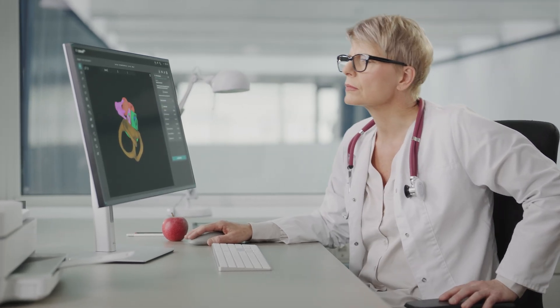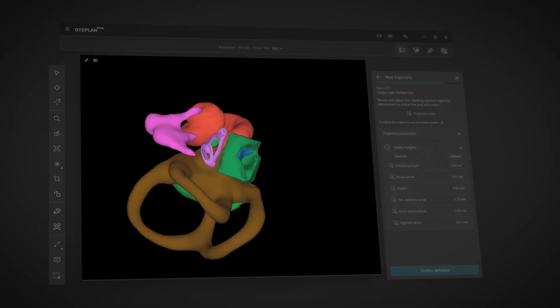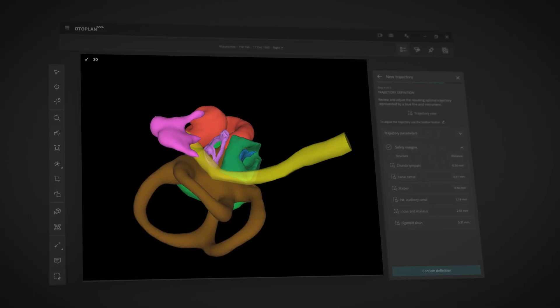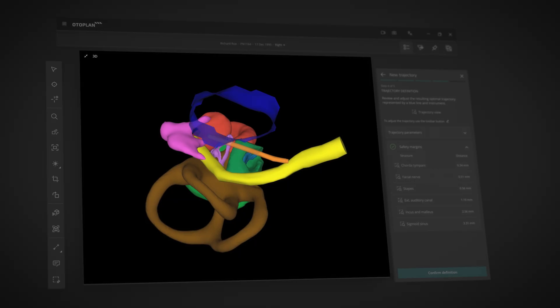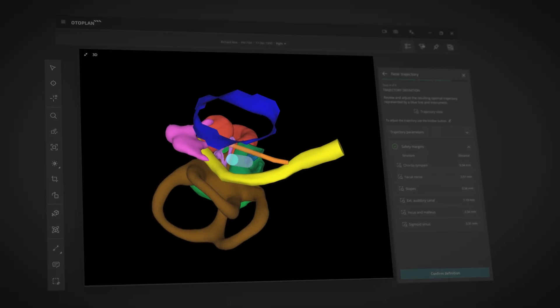And for patients with particularly unique or challenging anatomy, OtoPlan can help you optimize your surgical approach with virtual trajectory planning.